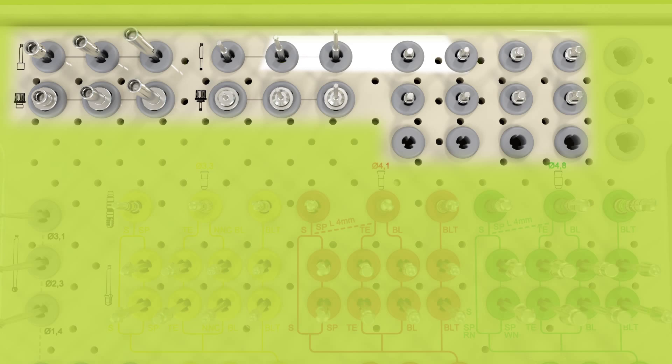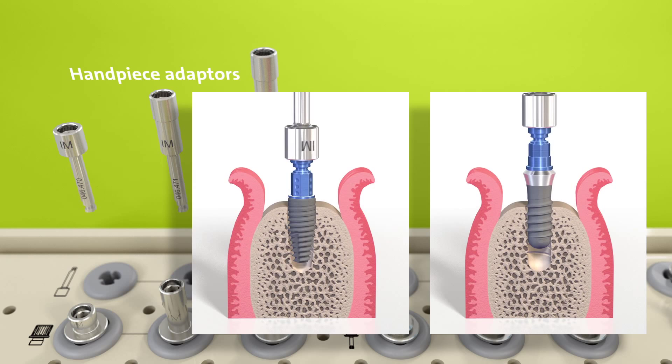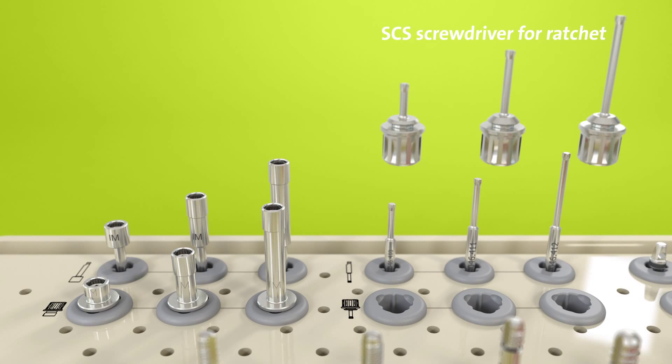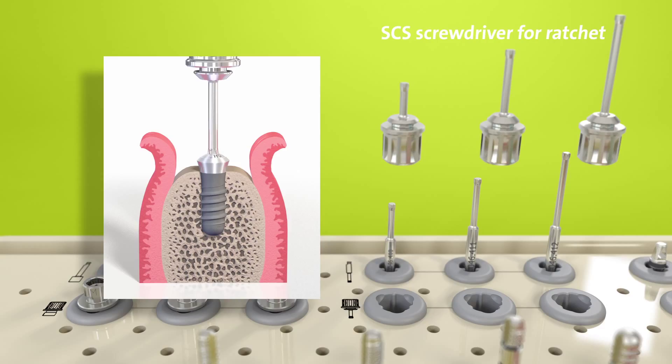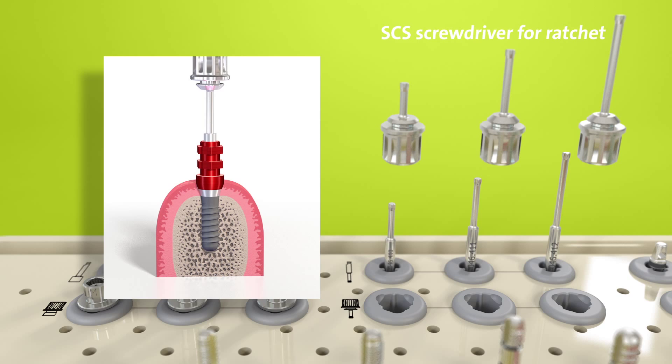In the upper part of the cassette layout, there are several compartments with gray inserts. The instruments in these four compartments are available in three lengths. Here there are handpiece adapters, which are used to pick up and insert the implant with a dental handpiece. Just below, the adapters for the ratchet are stored. Next to the adapters, you'll find the SCS screwdrivers for the handpiece and for the ratchet, as indicated by the corresponding pictograms. SCS screwdrivers are used to pick up healing caps and healing abutments, improving efficiency by connecting caps securely to the screwdriver and safeguarding them from being accidentally dropped. The same SCS screwdrivers can be used for handling the impression components and most other Straumann prosthetic components.